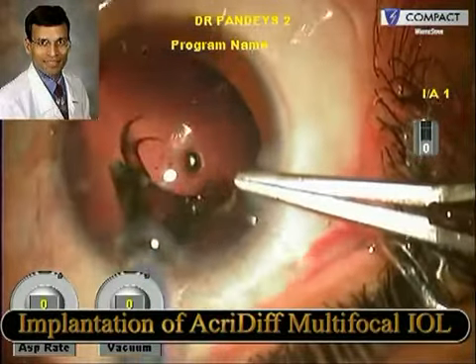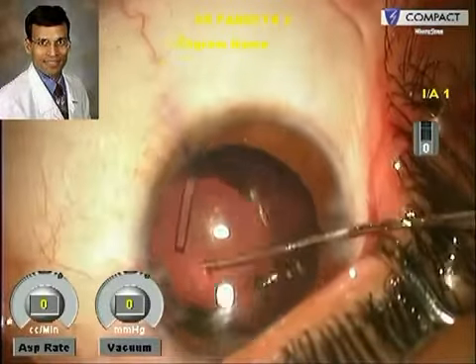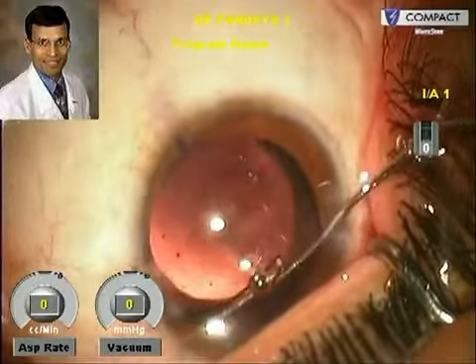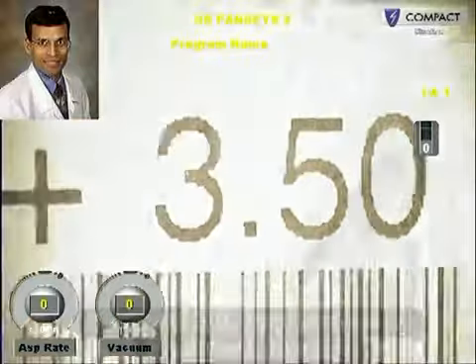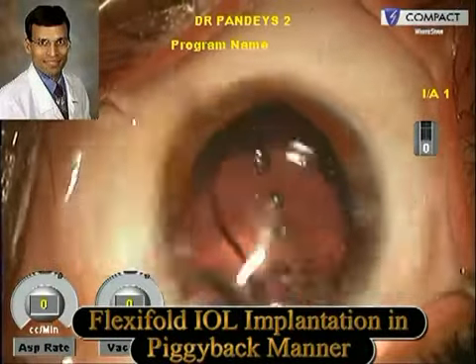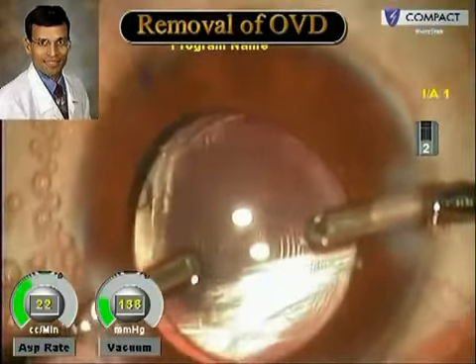In this case, a total power of plus 32.5 diopters was needed, which was not available as a multifocal IOL commercially. So we implanted one multifocal IOL of plus 29 diopters in the capsular bag and another plus 3.5 diopter hydrophilic acrylic IOL in the ciliary sulcus. We then removed the viscoelastic from between the IOLs.